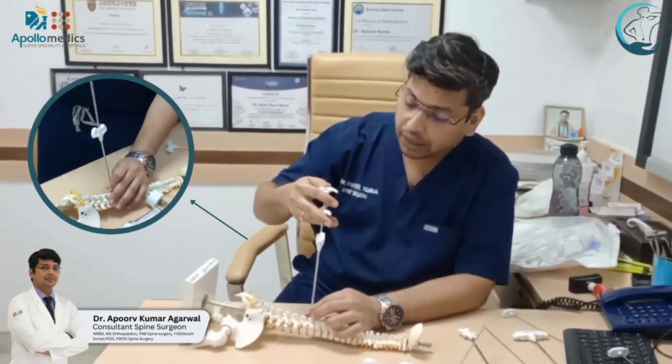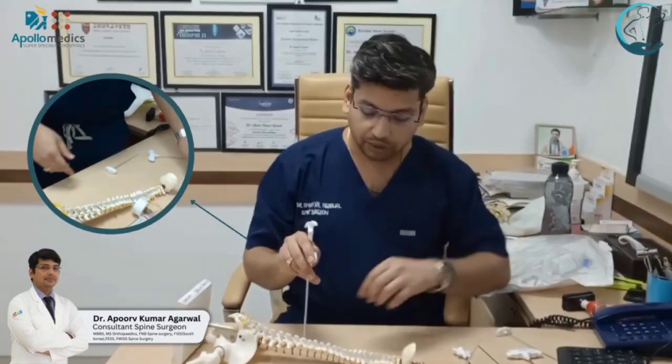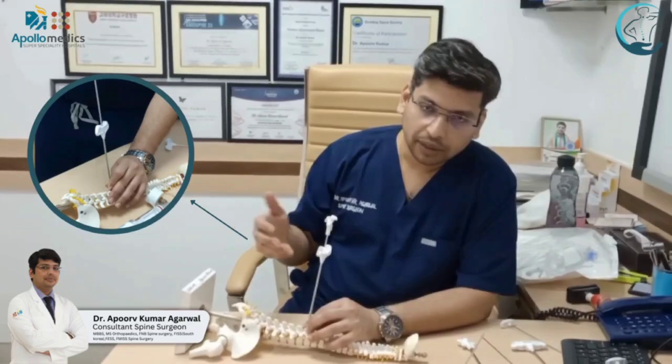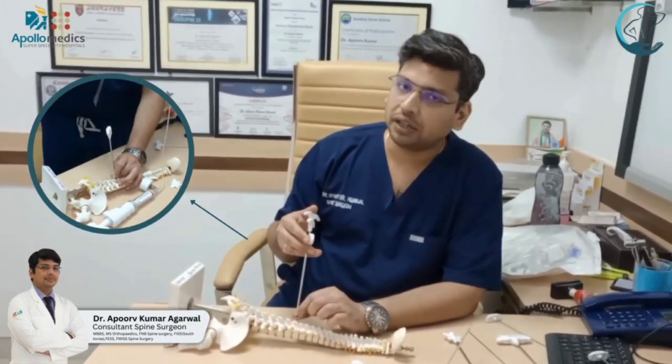We push the cement very gently into the space which has been created. This is done under C-arm guidance, and this is how our kyphoplasty is completed, fulfilling our procedure. Thank you very much.